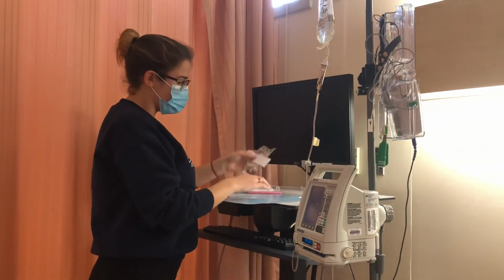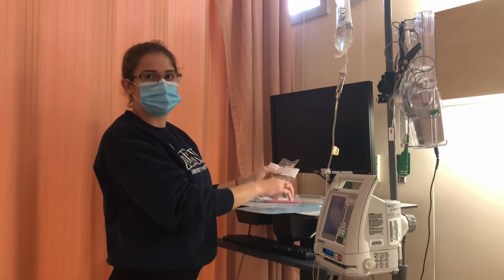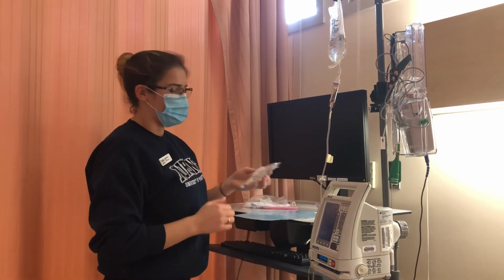I'm going to be hooking that. It's to be given every 4 hours, so I have 6 time slots. It's currently 1200 hours, which is one of the time slots to give it, and this med has not been given yet, so we're going to give it. So I'm going to educate the patient now.